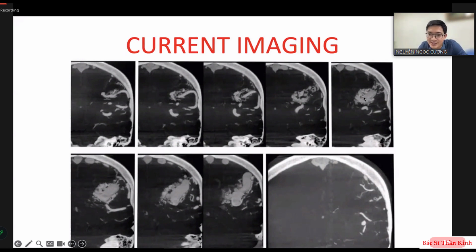In this image we start to see the vein. With this phase we have the nidus. We can define the nidus in this phase, and we can use this phase to analyze the feeding arteries and the components of the AVM and the drainage vein. This phase is a little bit late because we see the dilated vein clearly, and we see some small feeding arteries and almost all of the drainage vein. And this is the last phase. The drainage vein appears nicely here, but there are no feeding arteries to see. This is a very late phase.